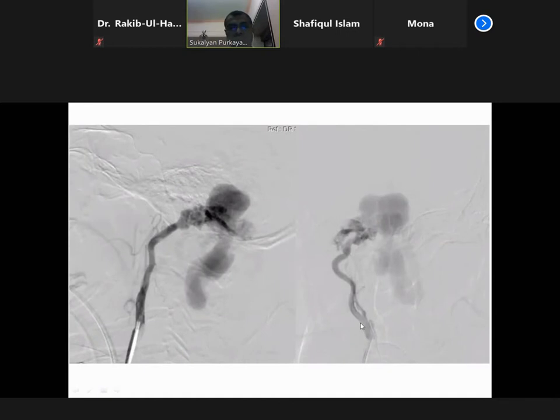So again, in this area, what we do is, because this is a very large artery, keeping a Marathon here or any detachable microcatheter, probably I used Apollo here, because I need some area for reflux, and I can't keep any catheter here, certainly for sure, if the Marathon gets blocked. So although my choice is Marathon, here I used a detachable microcatheter.